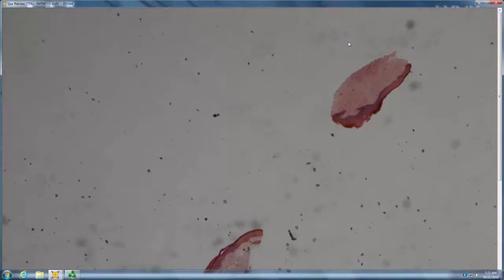Tiny biopsy. I just read them, right? We get what's sent in. I'm worried about radiation. I don't see the ectatic vessels. So you definitely see hyperkeratosis. You see some either atrophy or plate-like acanthosis, homogenization of the superficial dermis, pigment incontinence, all things you could see in lichen sclerosis.